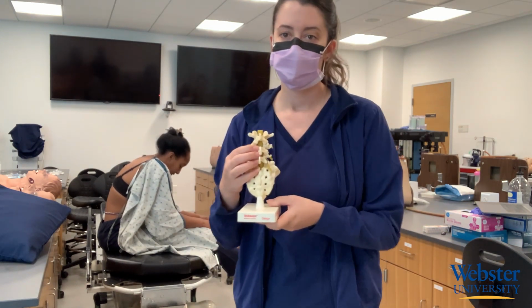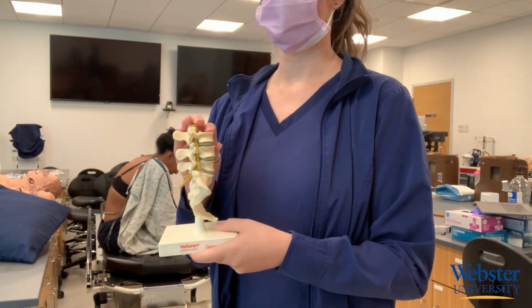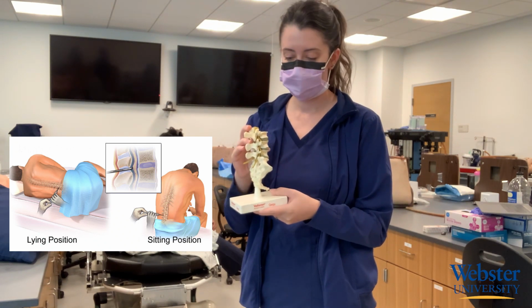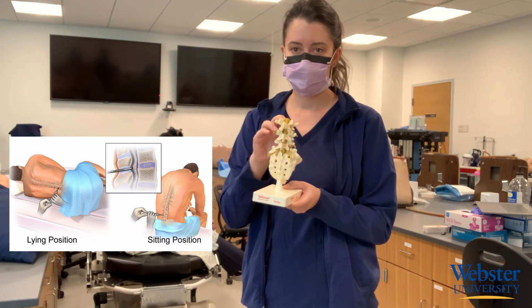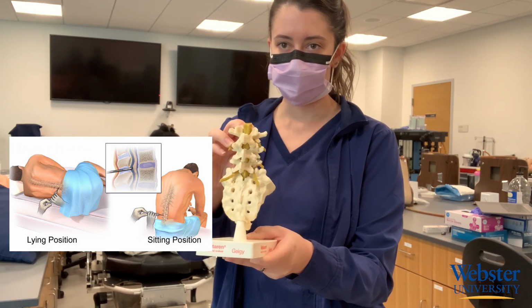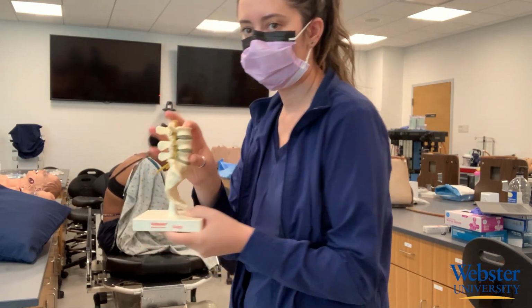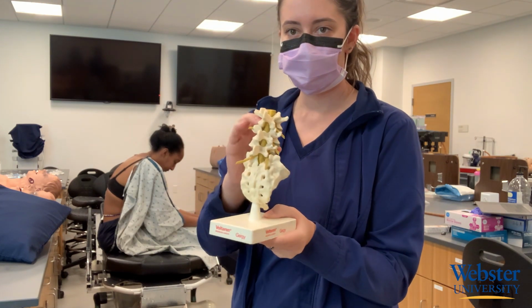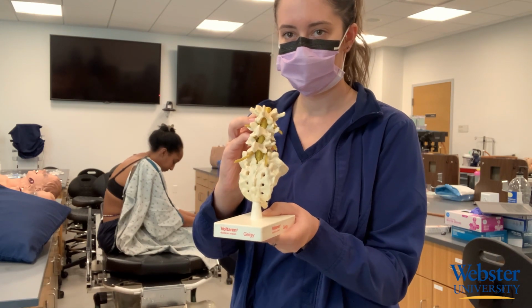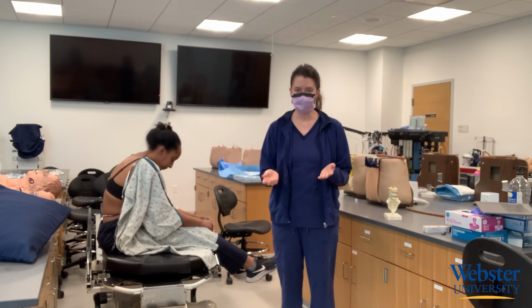This is important so the spaces that you're aiming for are as big as possible. So when you're looking at the spine, if somebody is sitting with really good posture, their spaces are very compressed and you cannot see the epidural space because the target is very small. But if you have them push out their lower back and hunch over, then their spaces open up and the target is much bigger. Sometimes patients have to be shown this position rather than just telling them to hunch over and push their back out.